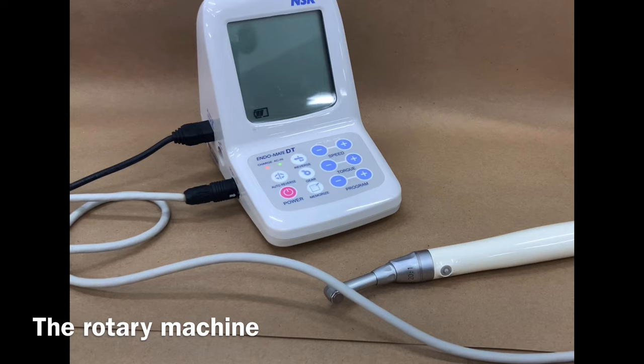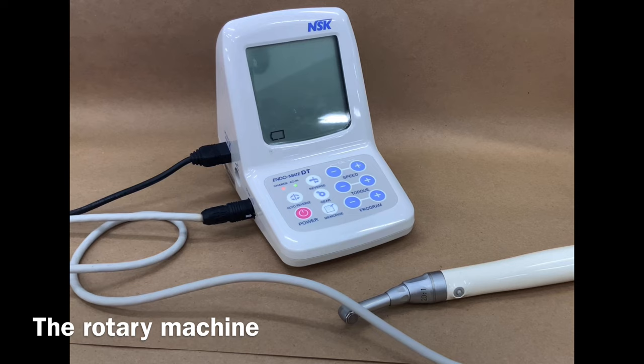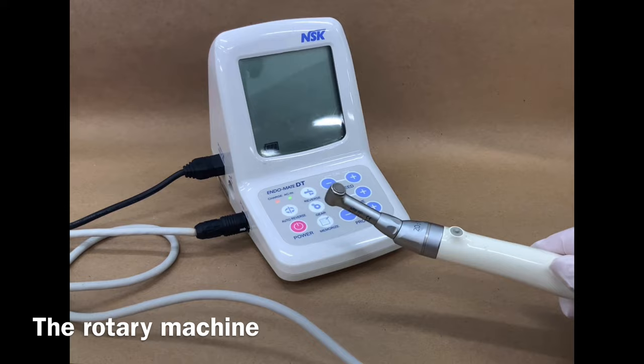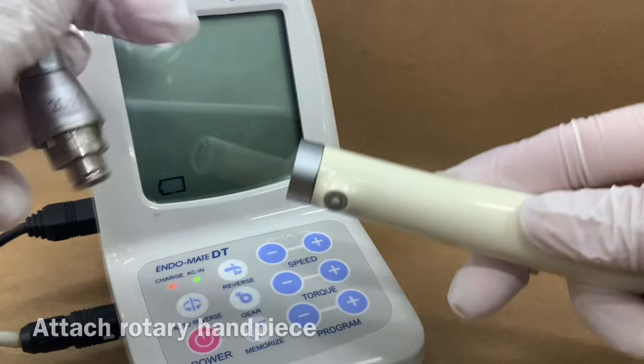This is the rotary machine that you will be using in both pre-clinic and clinic. It has two cords: one is a power cord, the other is a cord that attaches to the handpiece. Notice that there is no rheostat. Instead, there is a push button on the handle which starts and stops the rotary file.